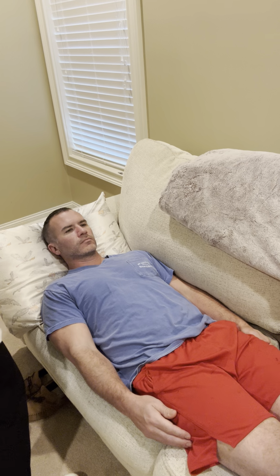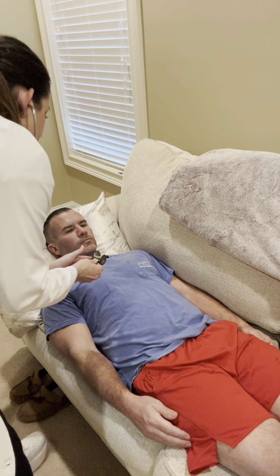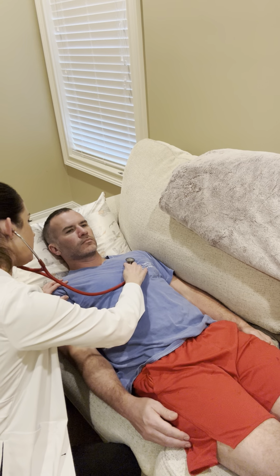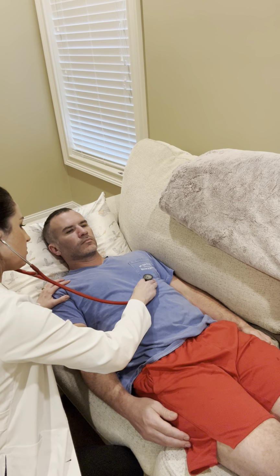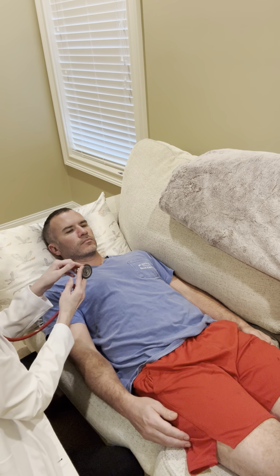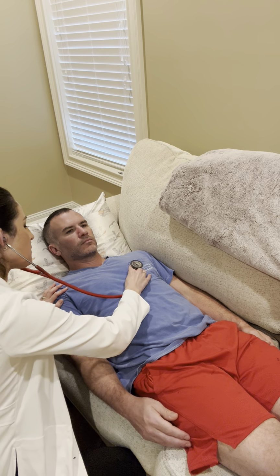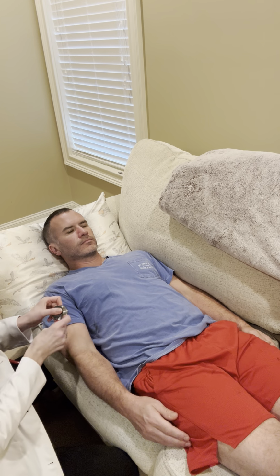Then we're going to auscultate again over the 5 points with the diaphragm. So aortic, pulmonic, Erb's point, tricuspid, mitral. And the bell, aortic, pulmonic, Erb's point, tricuspid, mitral. Then we're going to move on to the abdomen.